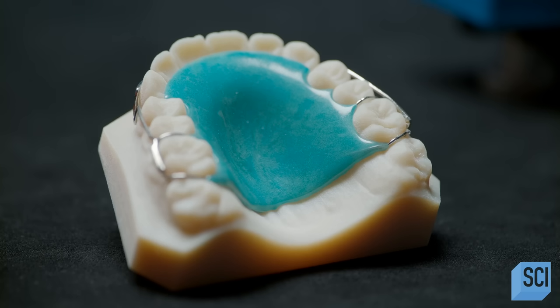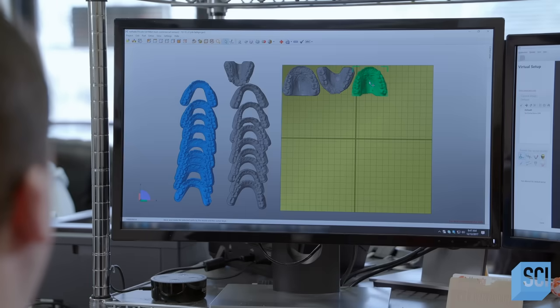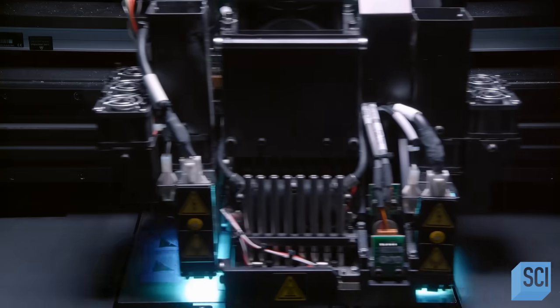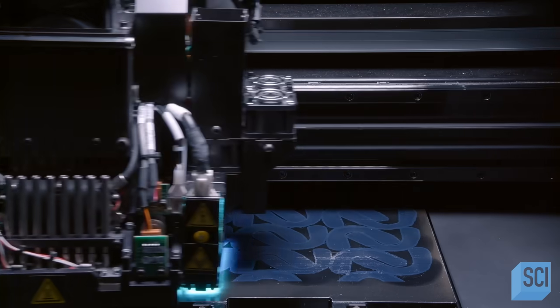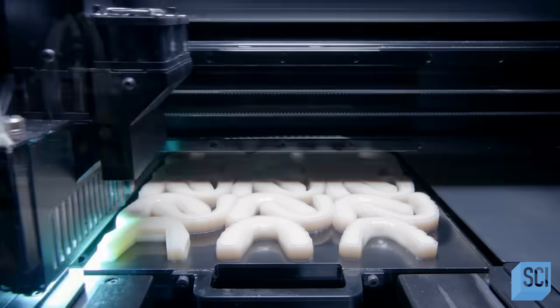Retainers are custom made for each person using a model of the patient's mouth. The orthodontist scans the patient's teeth and palate and sends the 3D images to a lab. A 3D printer builds each model by printing approximately 750 layers of material, which takes about four and a half hours.